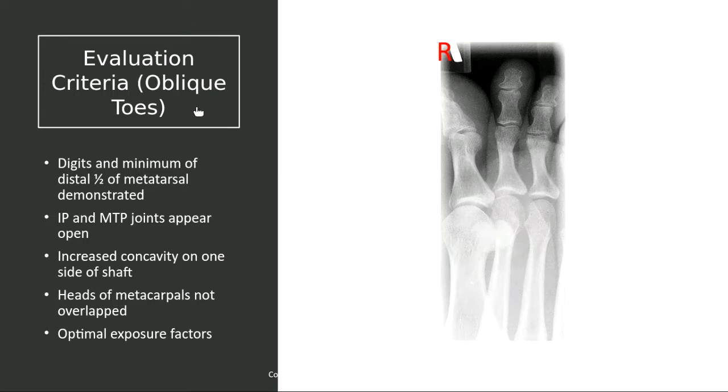The heads of the metacarpals, that should not say metacarpals, that should totally say metatarsals, should not be overlapped. Big oops right there. Here, let's change that right now. Metatarsals. Heads of the metatarsals should not overlap. And you want optimal exposure factors. Okay, and that is your oblique toes.